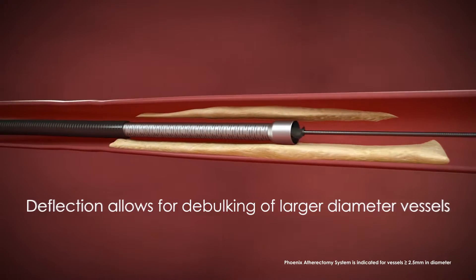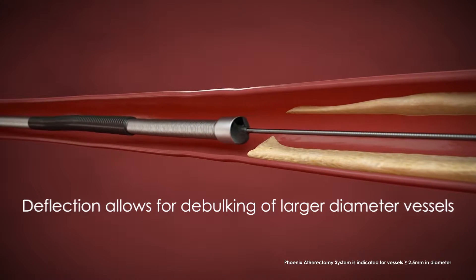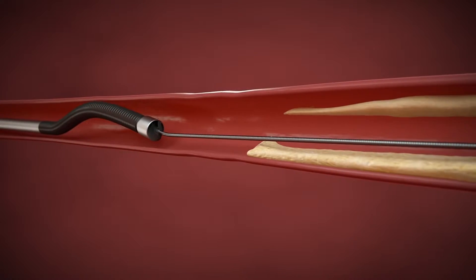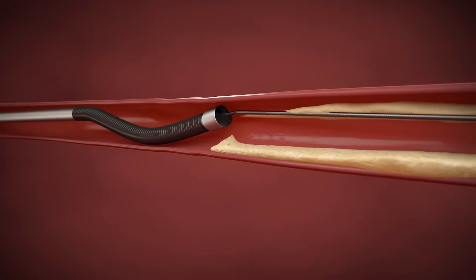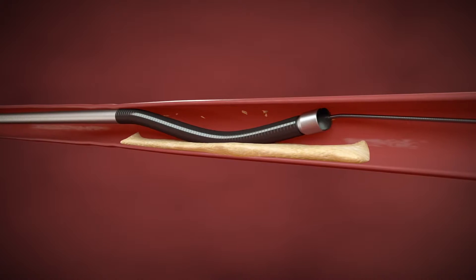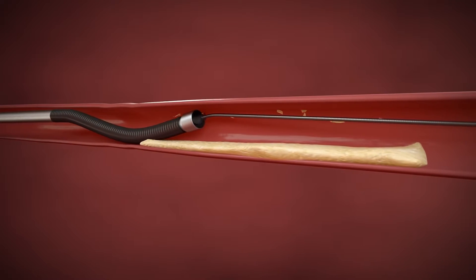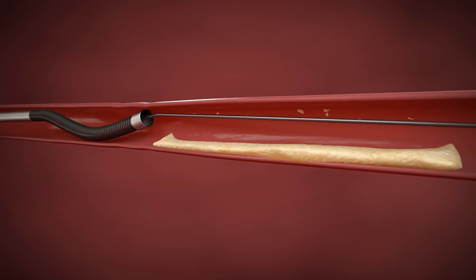After creating an initial channel by debulking in a straight fashion, the catheter tip can be deflected and rotated as needed to achieve the desired result. The 2.4 millimeter Phoenix combines all of the key design features of the smaller diameter catheters with the addition of an outer sleeve that facilitates the deflecting of the catheter tip.